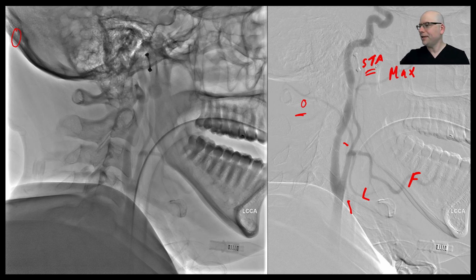And then I guess in the ENT world, the distal branch of the internal maxillary artery gives the sphenopalatine branch. And so for someone with refractory posterior epistaxis, that might be something that we embolize as an alternative or adjunct to endoscopic cautery. So there we have some external carotid artery anatomy.